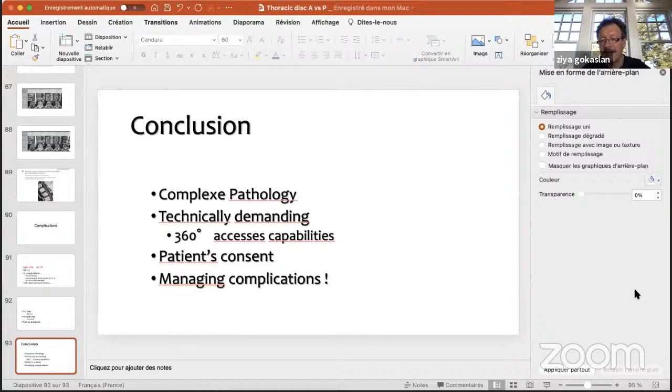And so for that reason, what we do now routinely in every case is get CT myelograms in all of these patients. Before the myelogram is ordered, we also ask the interventional radiologist to place a radio-opaque marker in the pedicle of the vertebra of interest. We use that marker in the OR to plan the incision, and also to localize the appropriate thoracic level, particularly in anterior approaches.